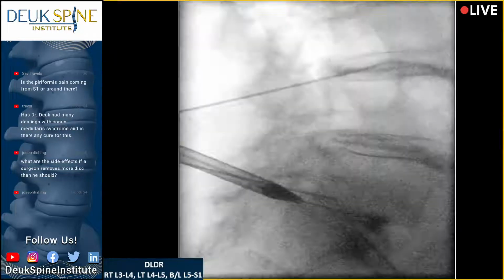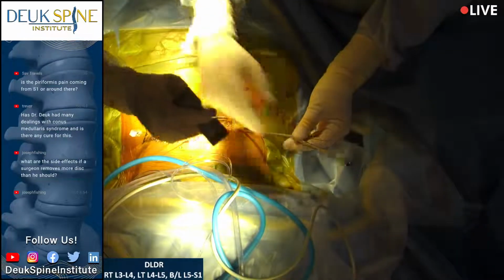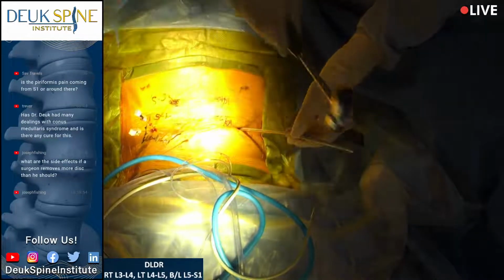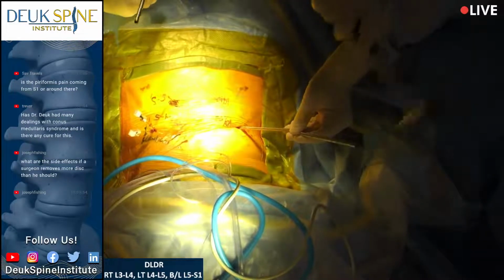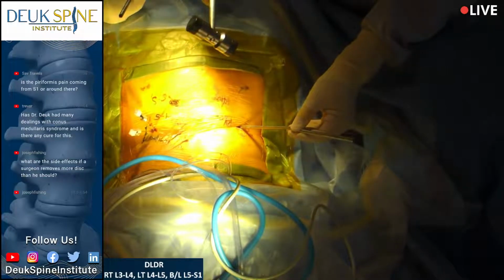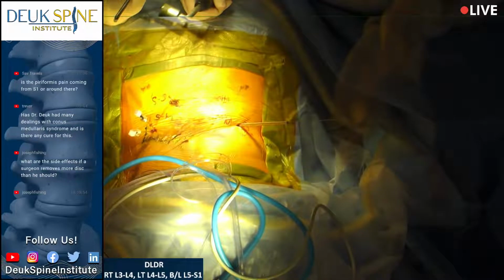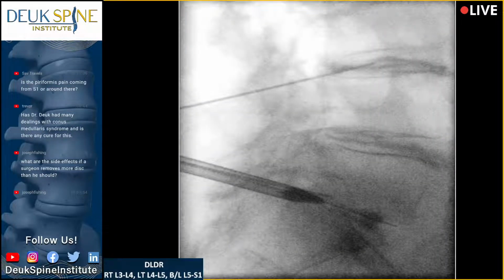So now I'm going to try a little different technique. Now that I'm entering the disc, I don't want to hit my guide wire, so I'm going to bring out my impactor and I'm going to try to drive this in, following the guide wire, which is the safe path. It's nice. I'm going to pull my guide wire back a little bit because it's trapped just slightly and advancing, and I don't want it to advance with the dilator.